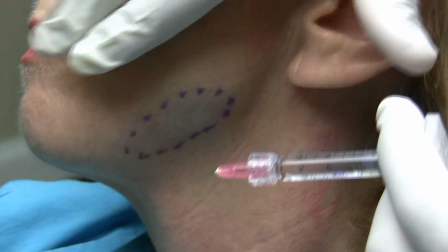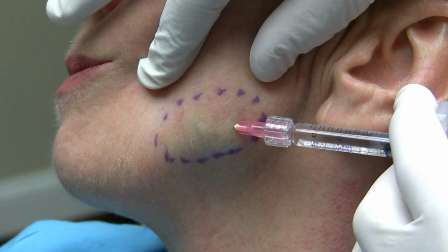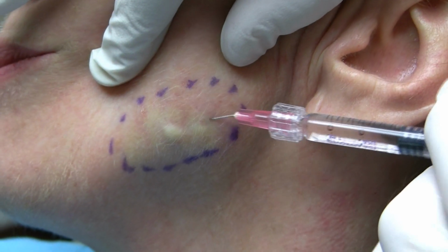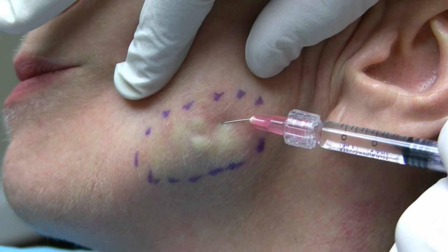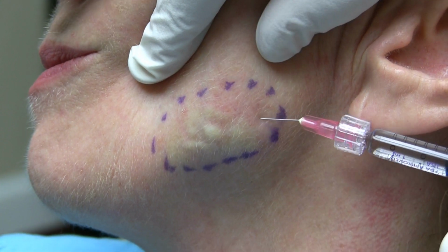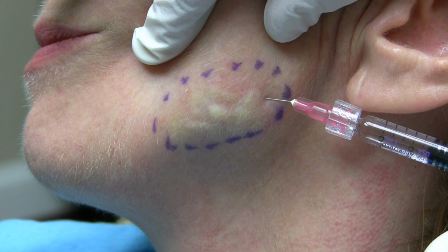All right, very good. So we're going to begin back here on the mandibular defect, and I'm going to pull it up over the mandible to give me a little bit more of a stable base. And for anybody that's familiar with topographic maps, how they have concentric circles that are wider at the base of a mountain, and then as you approach the top of the mountain, the circles are piled on each other and become thinner. That's sort of the same type of situation that I want to do here.